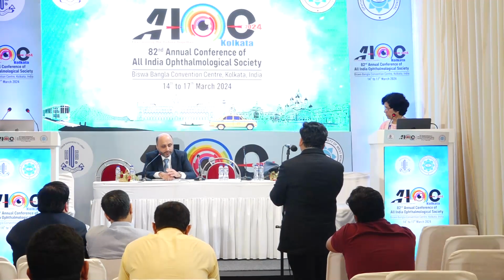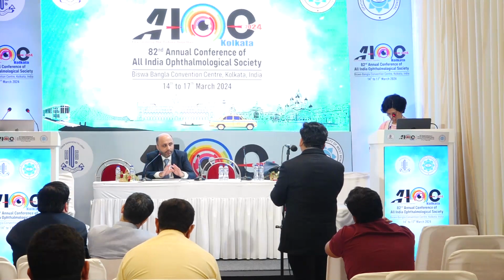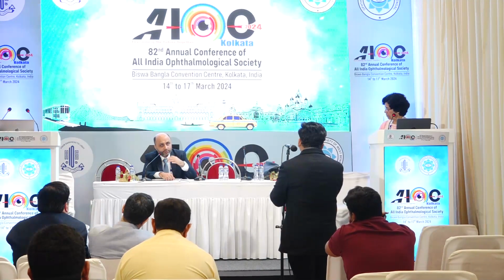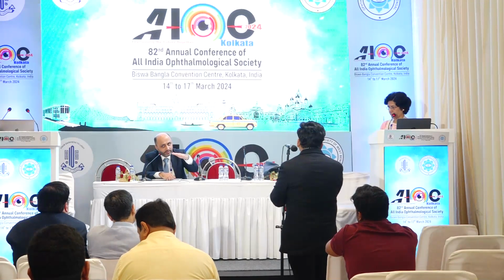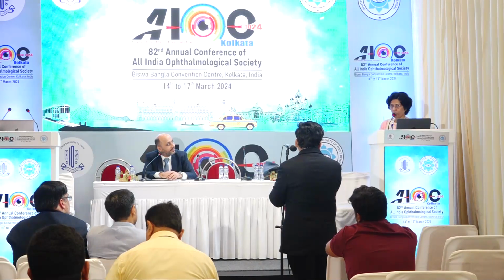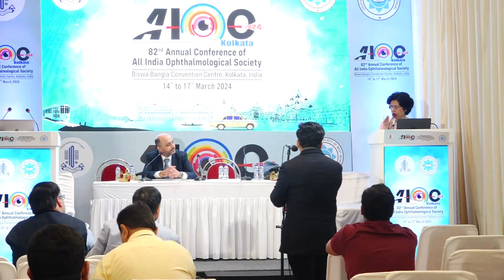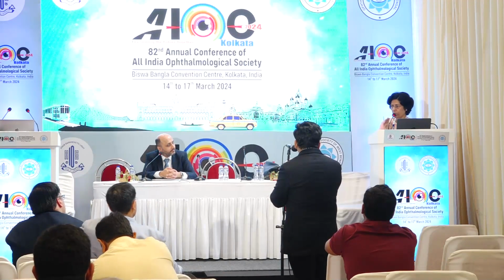And also, not for a combined detachment, but sometimes you have these very high TRDs, and if you're able to manage the membrane, and you're very sure that you've not caused any iatrogenic break and there is no break, what is your threshold for using a tamponade, even if you're a little scared of something, or are you able to leave a very high TRD and let it settle on its own? So what's the take on that? So if there is just a TRD and there is no iatrogenic break, if you are sure there is no iatrogenic break at all, then actually I don't do any tamponade.